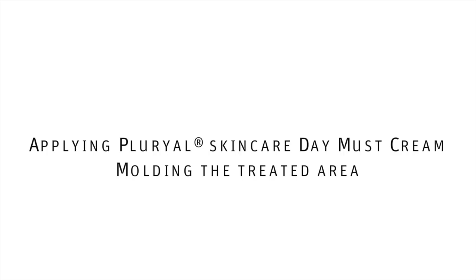I wouldn't use a cannula here because the trauma for the tissue would be far too high. I immediately mold the area I injected with some Pluryal Day Cream in order to check what I did.